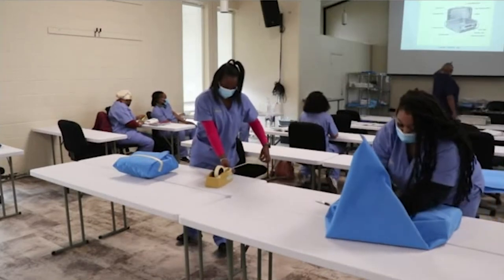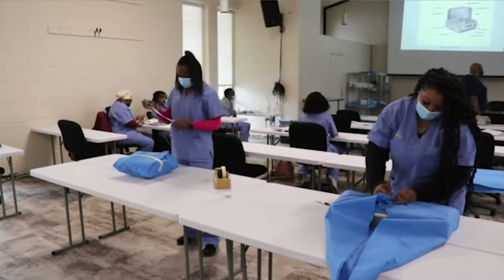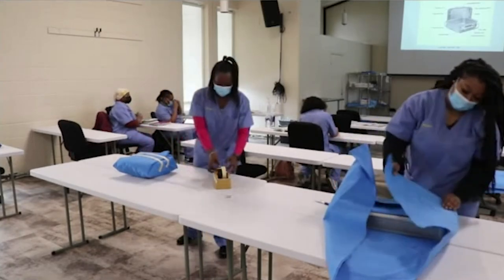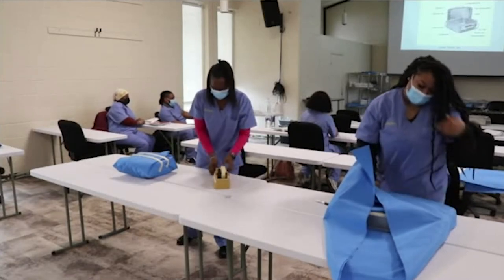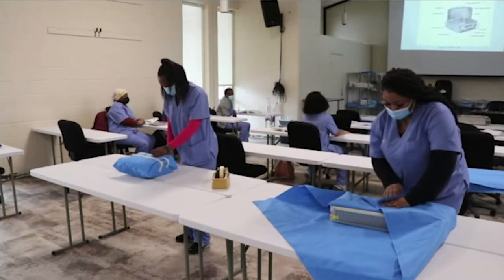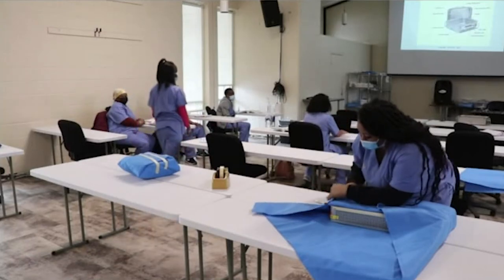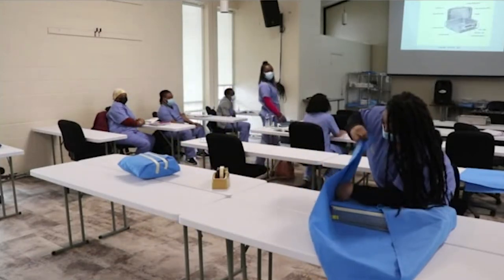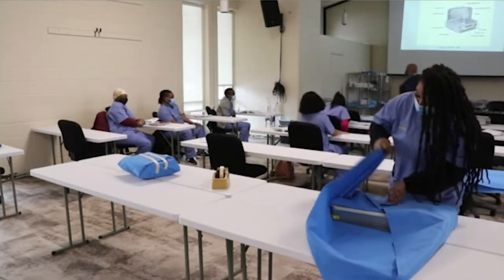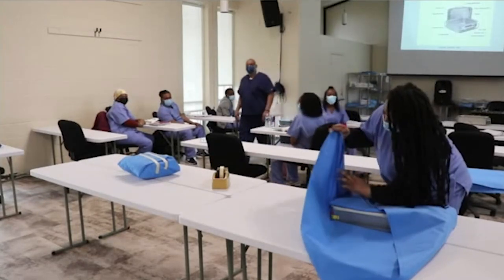Okay, so Jermaine, these rigid containers, when they come back to you, they should come back separate. If you're in decontam, this is you guys, you have to set her up real nice. Back together? Good question. How about as you go? What you want to do, that's good. Jessica, that's good. Keep going. You got 30 more to do. You'll be fine.